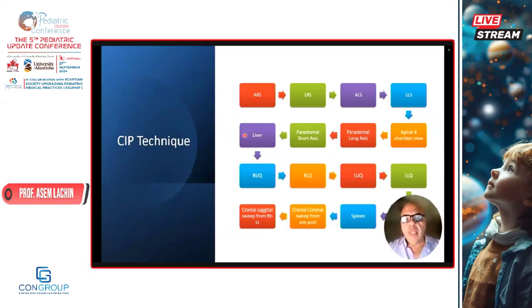Then we'll go to the abdomen, 1 view to the liver, followed by mini abdominal views: right upper quadrant of the abdomen, right lower quadrant of the abdomen, left upper and lower quadrant, then going to the midgut, spleen, and finish the abdominal ultrasounds, again seeking for effusion, ascites, fluid collection, hemorrhage, and/or ischemic bowel.